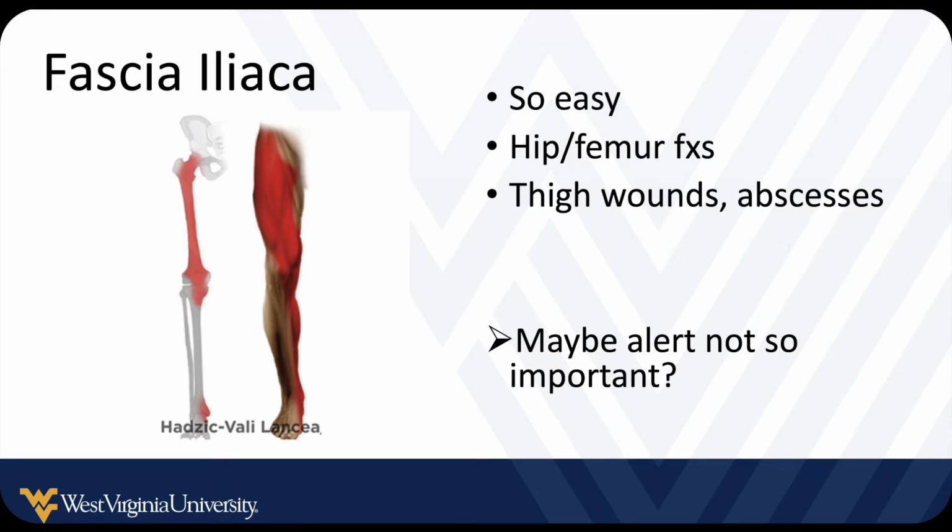This is a nice, easy block. It's great for hip and femur fractures. The most common are the hip fractures that we all see every day. But don't forget to think about it if you have a large thigh wound that you need to clean out and repair, or a large abscess somewhere on the thigh. And again, because you shouldn't have your needle right up against a nerve or an artery, some of these older patients who have hip fractures, sometimes they have some dementia or something else. In these patients, that's okay, because again, the risk is lower.